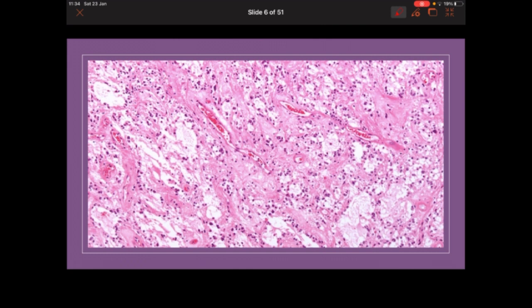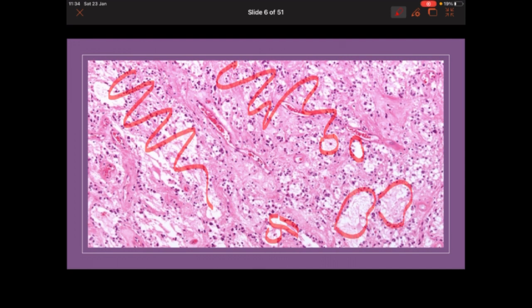Let's see the histomorphology features of the pilocytic astrocytoma. How does the pilocytic astrocytoma look under the microscope? In this low power view, we can appreciate the typical biphasic pattern of pilocytic astrocytoma. We can see that this is the loose microcystic area, and again this is also the loose microcystic area. We can recognize the microcysts. These spaces that are present within the tumor we call microcysts.